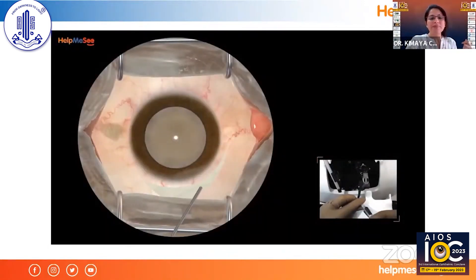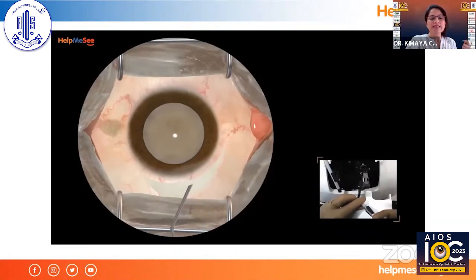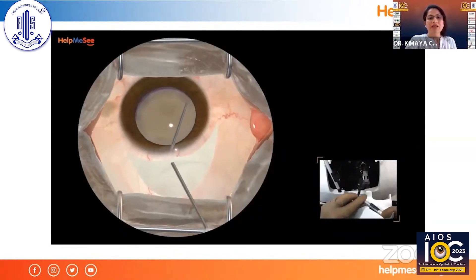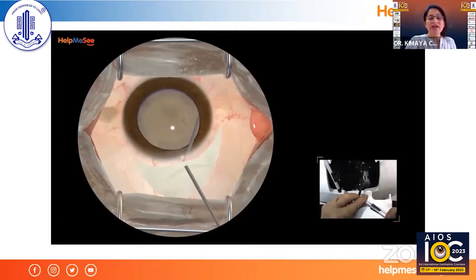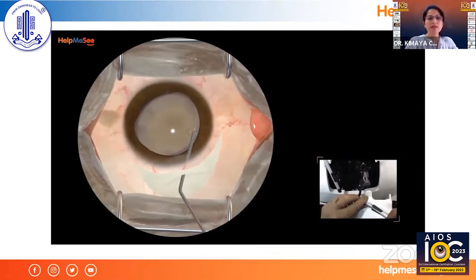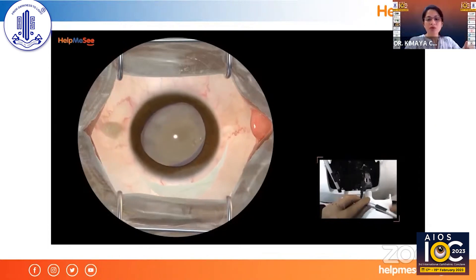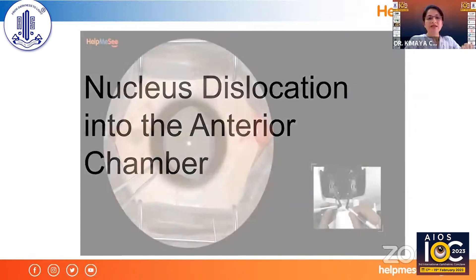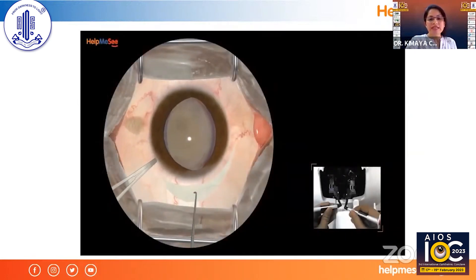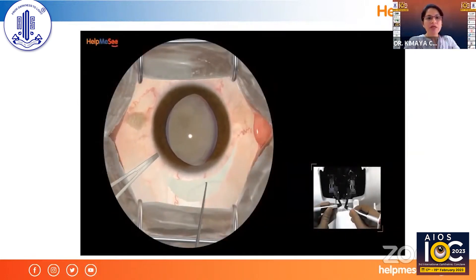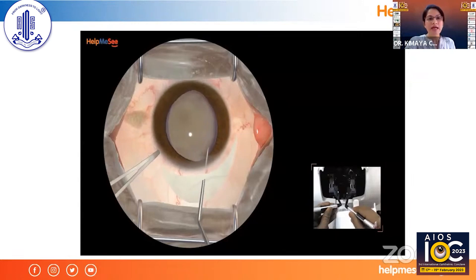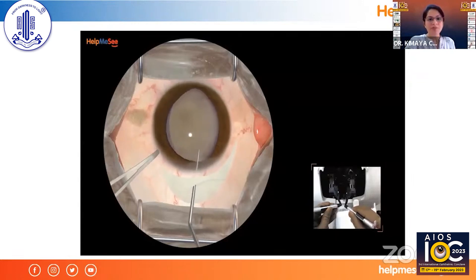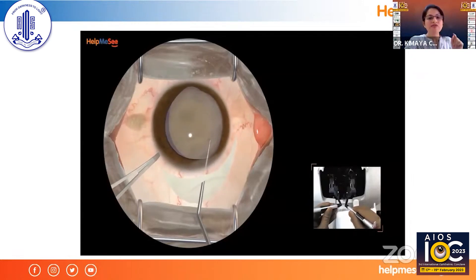Moving ahead — this is hydrodissection. I'm going inside the capsule margin, you can feel the capsule, and the nucleus is coming out. Now I'm getting the nucleus out using sinski, cartwheeling it and bringing it into the anterior chamber — the same feeling as in live surgery.